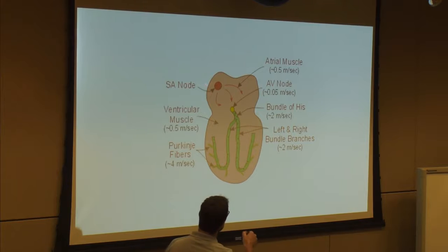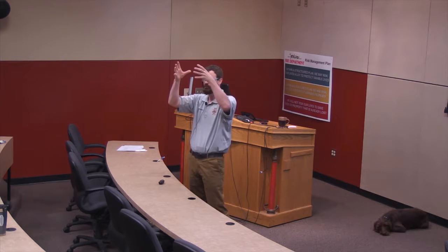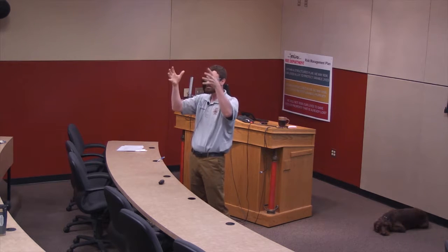So what does that give me? It gives me a spontaneous event. My P wave is the excitation and depolarization of my atrium. My AV nodal delay is my delay at the AV node, then the rapid conduction of that signal throughout the ventricle so that I get a simultaneous squeeze of the ventricle. If I had a slow conduction, then what would happen is my ventricle would squeeze from top to bottom, right? You'd be milking the heart instead of squeezing the heart. You'd be like, psh, psh, psh, like milking a cow, right? Instead, I take all of that blood and I squeeze it all at once, right?